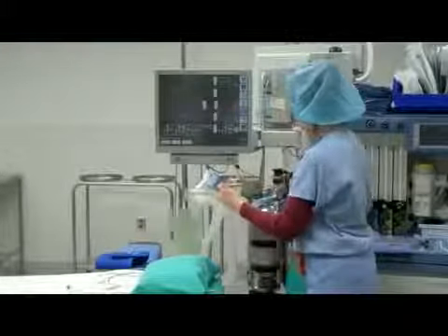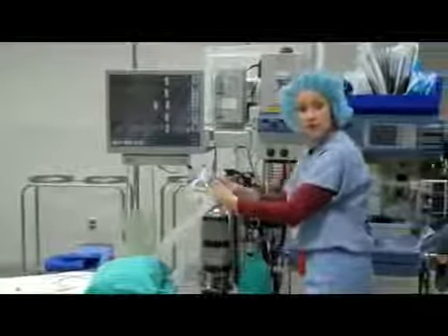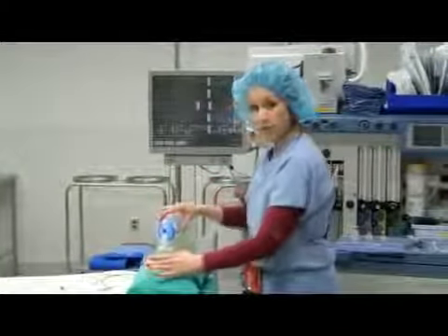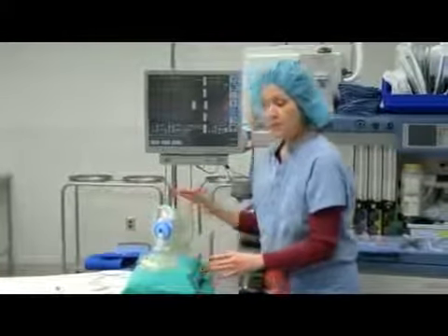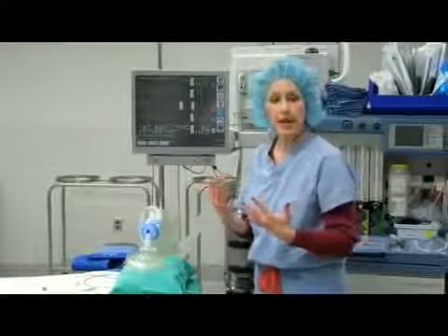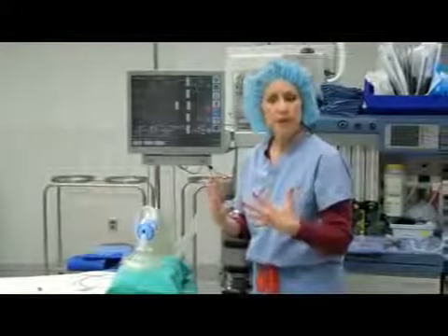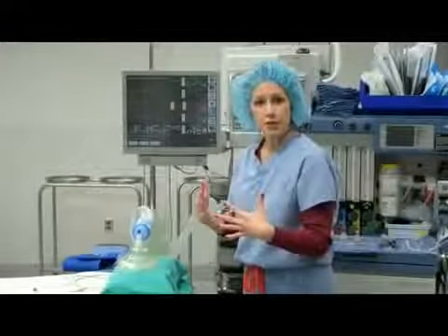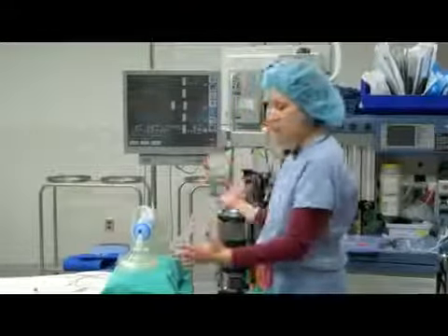So then we're going to have the patient breathe in some oxygen through a mask. We'll put the mask on top of the patient's nose and mouth. The reason why we do this is because the patients are breathing in room air, and the room air at this point is full of nitrogen. We need to get rid of the nitrogen in the patient's lungs, so we have them breathe in fresh 100% oxygen.